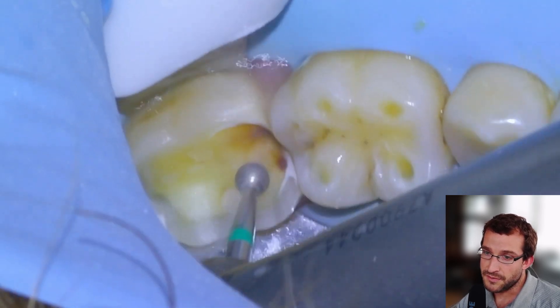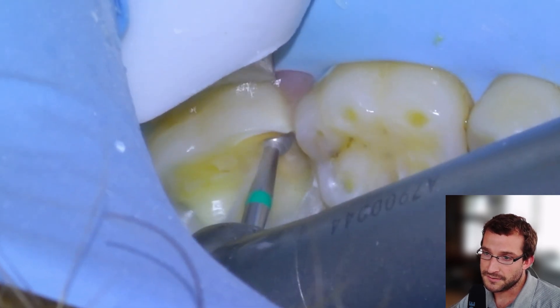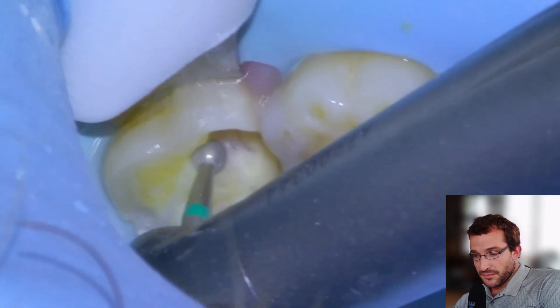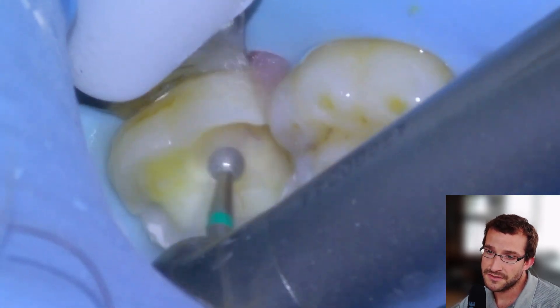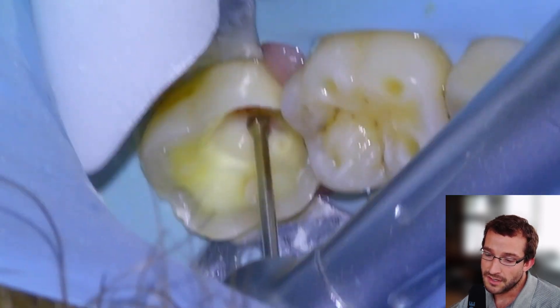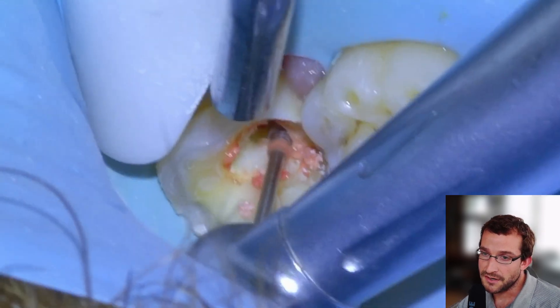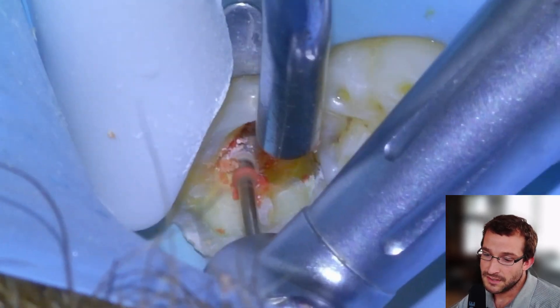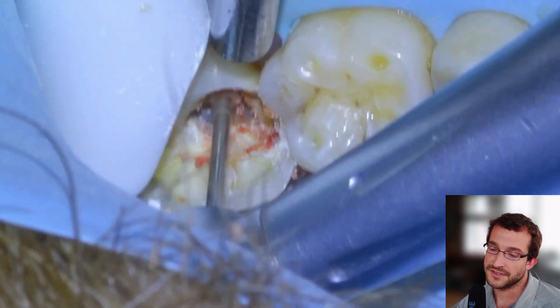We're going to go in with a large round diamond next and remove the tooth decay. We know right off the x-ray and just the presentation that it's going to be well subgingival, so we're going to be using the electrocautery tip in this one. We also know it's going to be a vital tooth, so we're going to warn the patient that as we're entering the pulp chamber and even instrumenting the canals, they're probably going to feel some sensitivity here and there — which is normal. A little intra-canal anesthesia can help, but it's almost unavoidable even if they are very profoundly frozen.